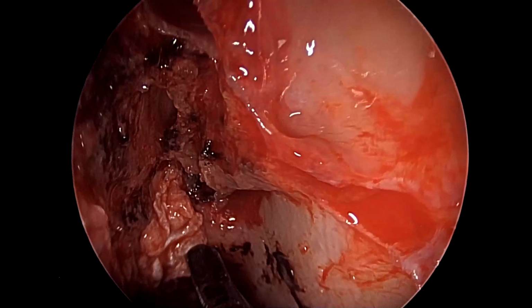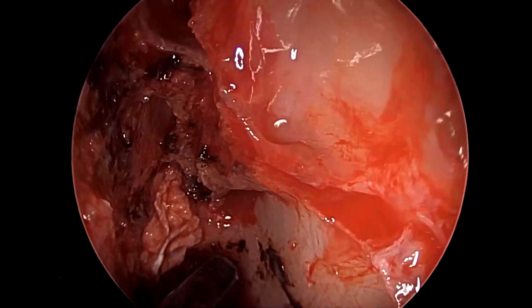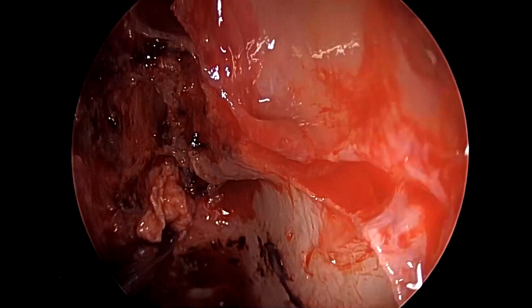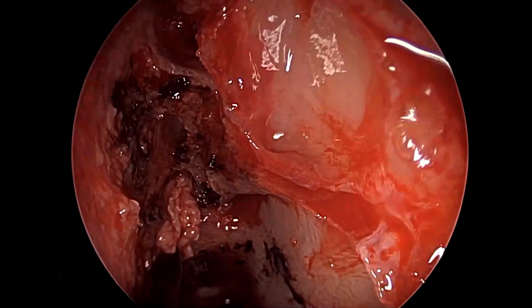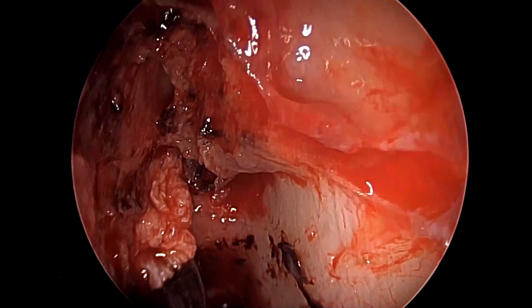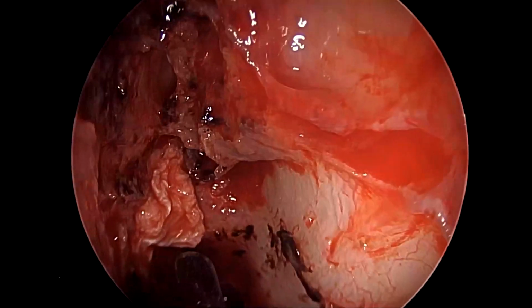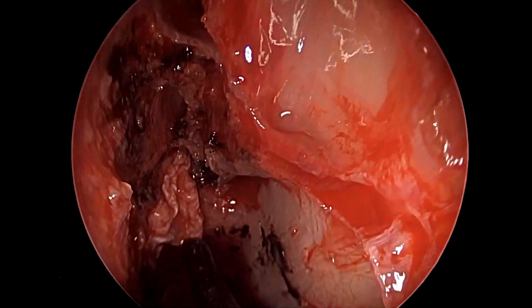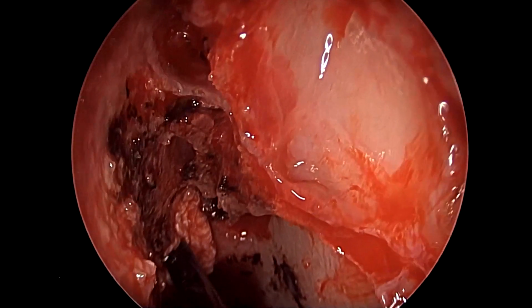access. We see here we have taken a measured portion of fascia lata to be the first layer that we want to insinuate between the dura and the skull base bone for closure. We're using a double angle elevator, again the one that was previously used, to try to insinuate and push gently all around this fascia graft as a sandwich between the dura and the bone.